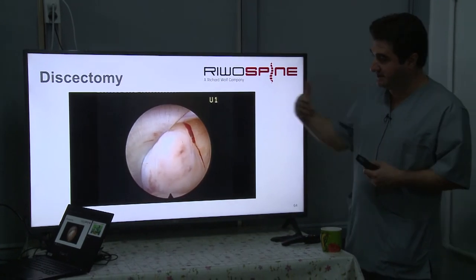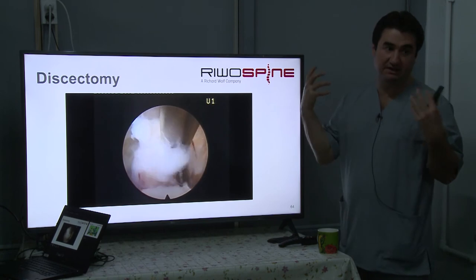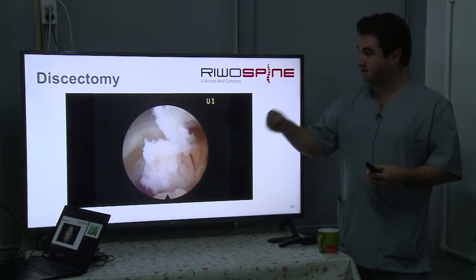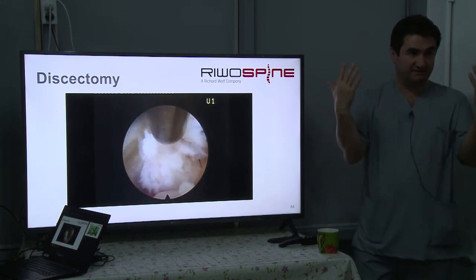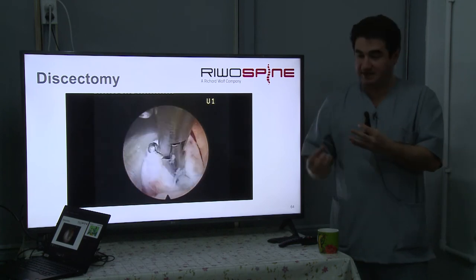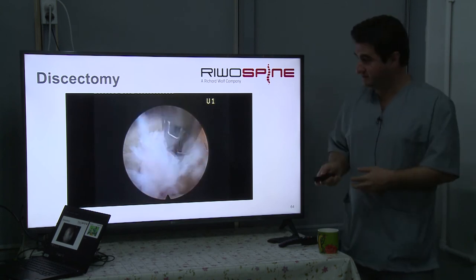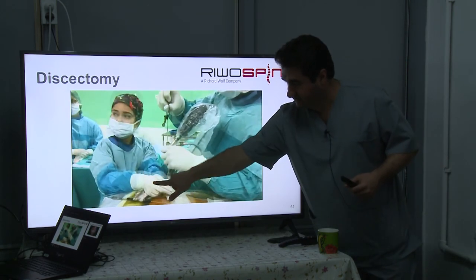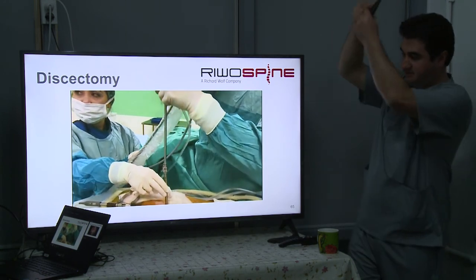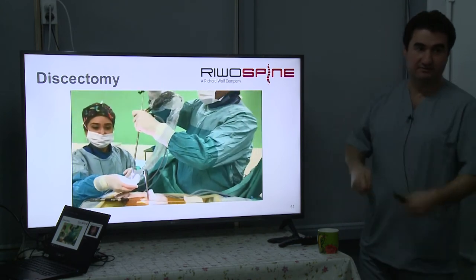Then we continue with the herniation. When you open the herniation like that, the pieces come out like this. And you can take them piece by piece, and the water will take them out. But sometimes it's really big and does not fit the working channel. Then what do we do with the big fragment? We ask our assistant to keep the system, and we take it out like this with the system. Okay.